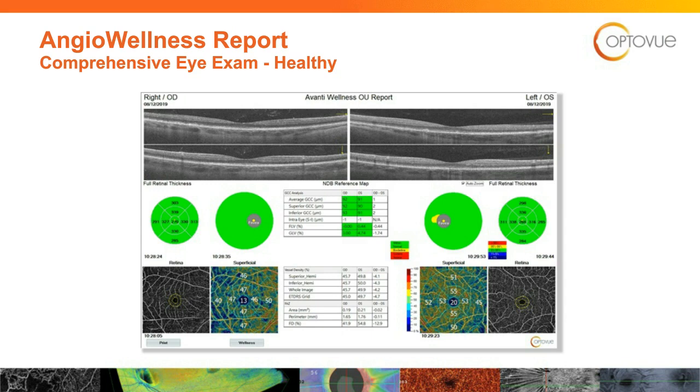That's great. We drop down here to the focal loss volume. That's another test there for glaucoma, a very strong indicator. When it's yellow or red, we need to investigate whether or not it's glaucoma. So I say that the scale is right beside it. Green is normal, yellow is abnormal. So green is good, yellow is caution, red is bad. You can see all your numbers are in green, which translates to the 2 little green circles to either side of that box.